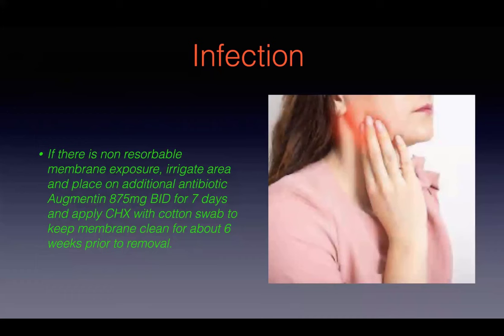And regarding the bone graft without membrane and collagen plug, you don't necessarily always have to use a membrane or collagen plug. But I think what's more important is to use a membrane and collagen plug and not necessarily always use a bone graft. Let's say, for instance, you have an extraction with immediate implant placement. Let's pick tooth 8 or 9. You take out tooth 8 or 9, you put the implant in, and you have maybe about 2 millimeters or less between the surface of that implant and the facial plate. You don't necessarily need to put bone graft in there. As long as that jumping distance, and there's literature on this too, is less than about 2 millimeters, it just forms. You don't need to worry about that.